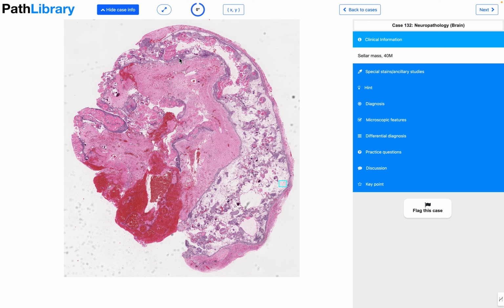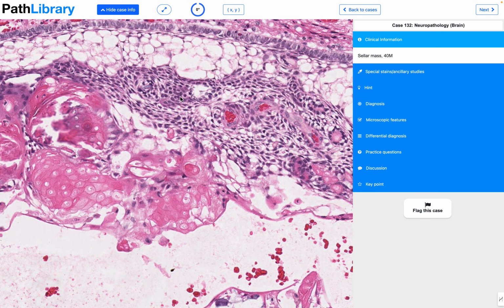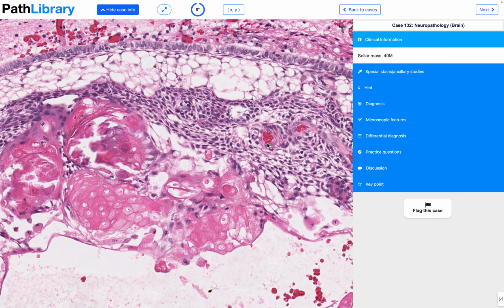So what makes me think that? It's location. And then besides that, the histology: you see some basal palisading of these cells. You see this edematous epithelium that's very faded with a lot of white space. So that's your stellate reticulum. You see some ghost cells here, and you see this wet keratin where they don't have nuclei, they're very compact epithelium.